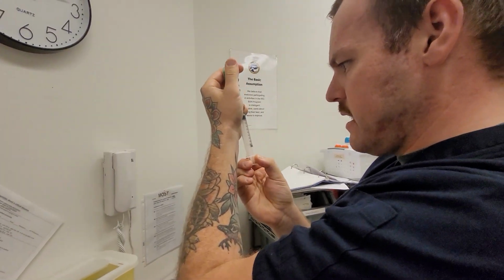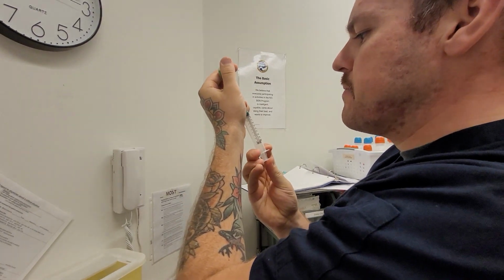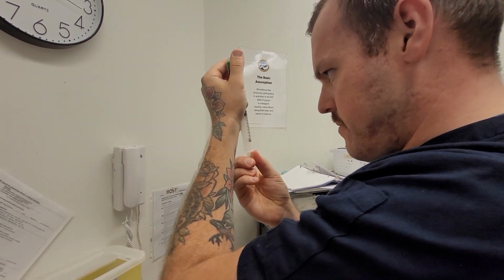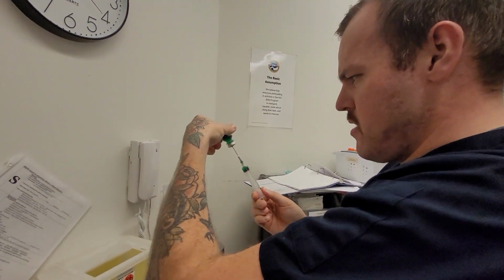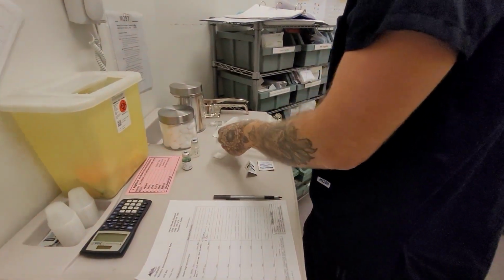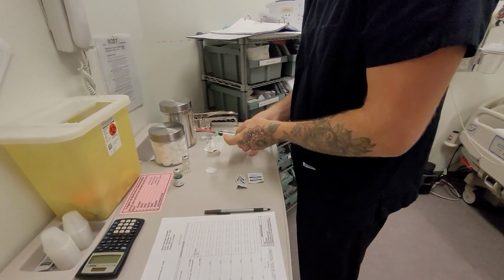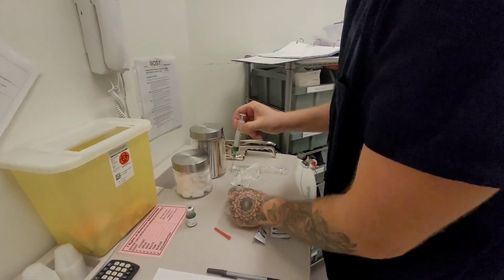It's a little bit sticky. It's pretty full. There we go. We've got 1 mil there. I'm going to do proper method here. I actually don't have to do that because we're going to be adding just 9 mils. So go ahead and keep that on the table here.